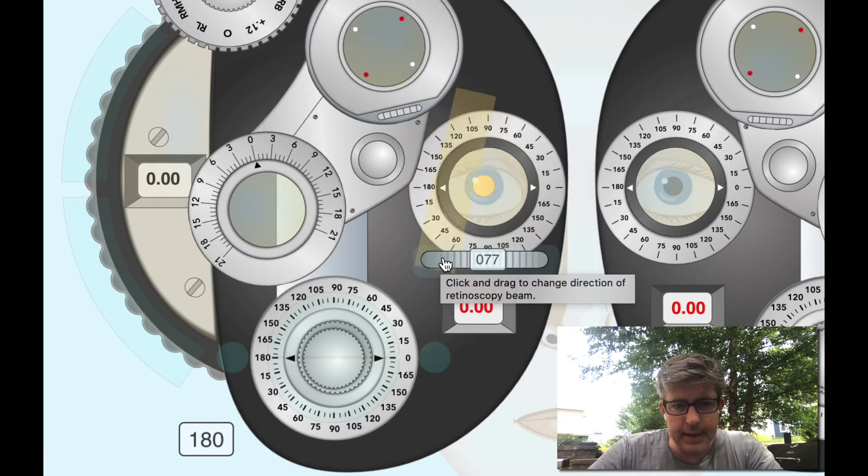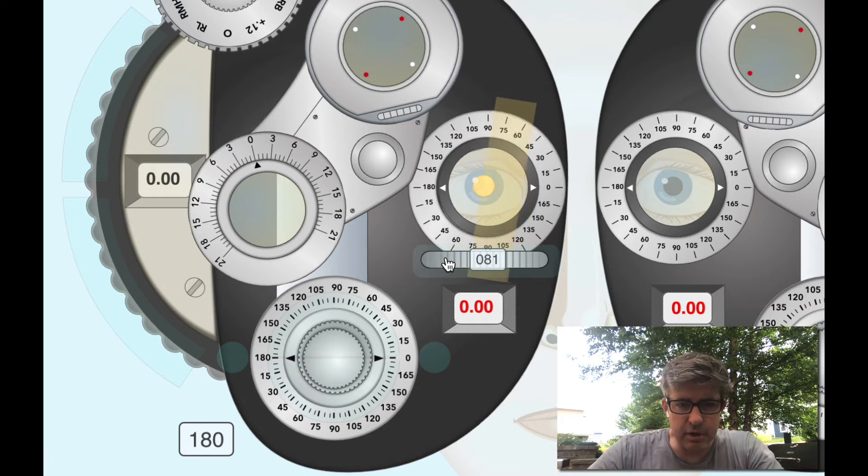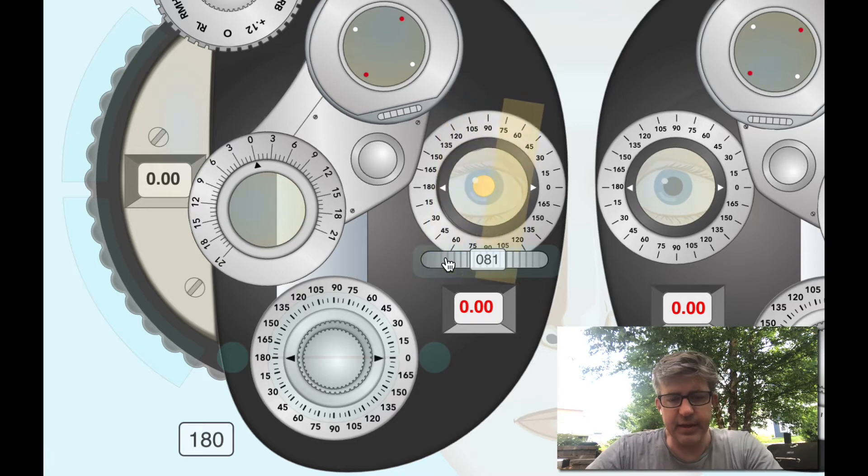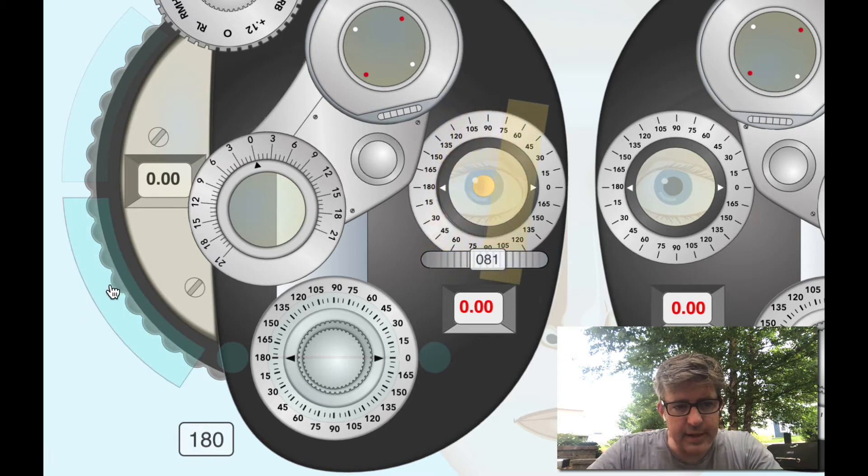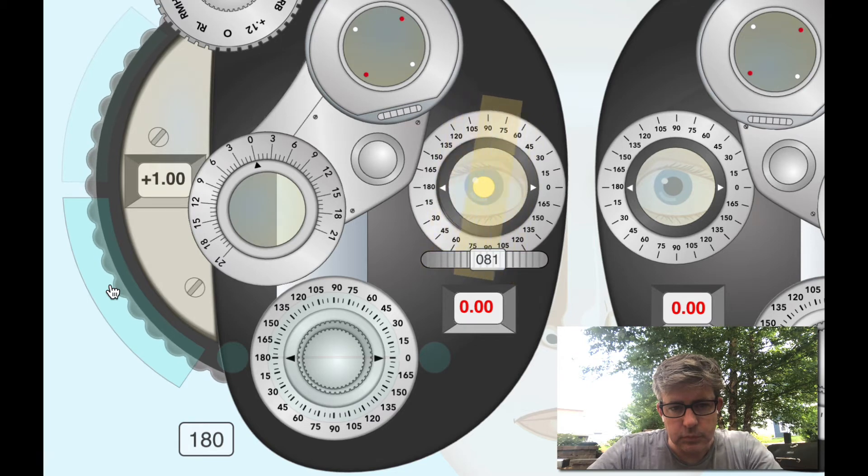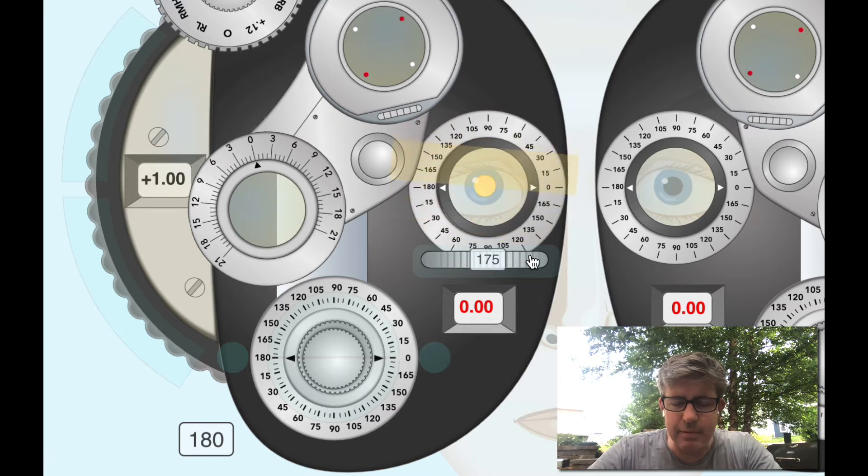With motion here, with motion here. But I'm doing a minus cylinder retinoscopy here on a minus cylinder instrument, so I want to refine and neutralize the more plus or less minus power first. Let's do that. Let's give this some plus until this gets neutral. Ah, that's neutral. Let's go to 90 degrees away.